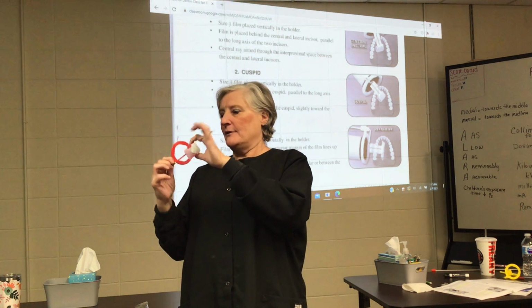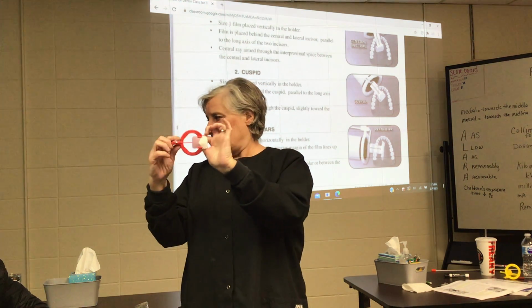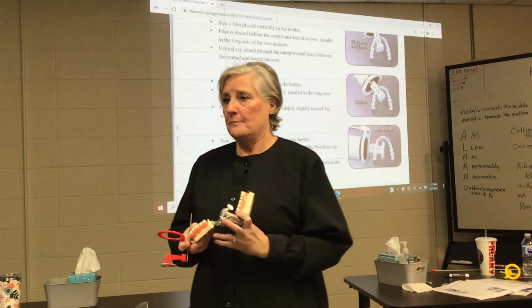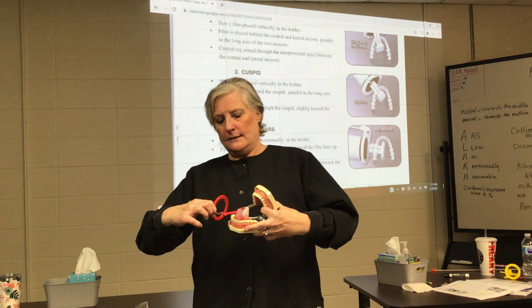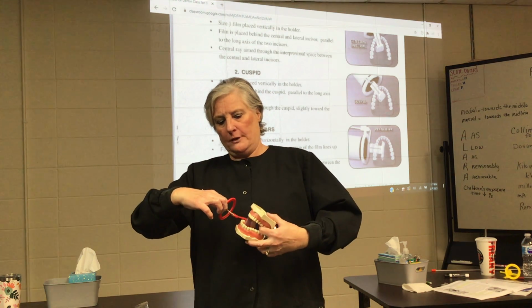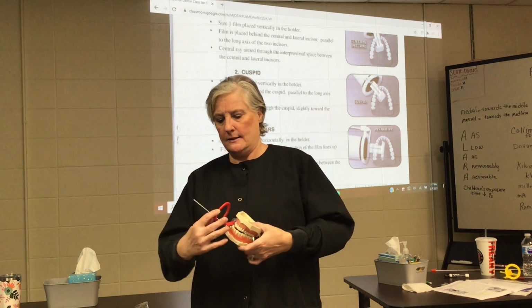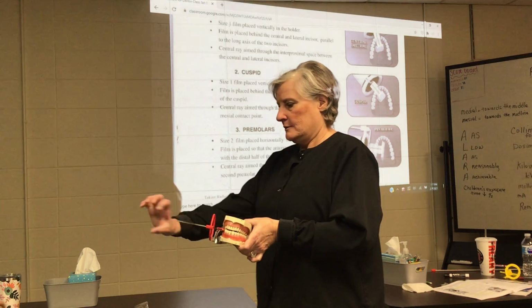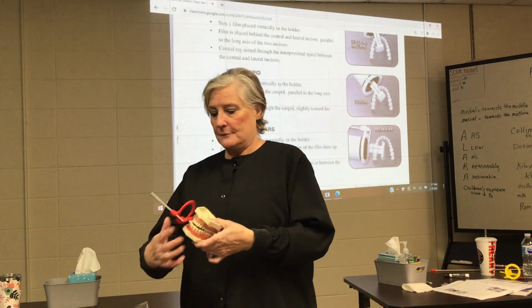This bar right here makes it so half the lower teeth and half the upper teeth are gonna be shown, but no roots. Okay? Bite wings have no roots. Okay, so I'm gonna place it back here in the molar region, and I'm using the lower teeth as a guide, because they're easier to see. Half inch, PID, flush and parallel, zap, done.